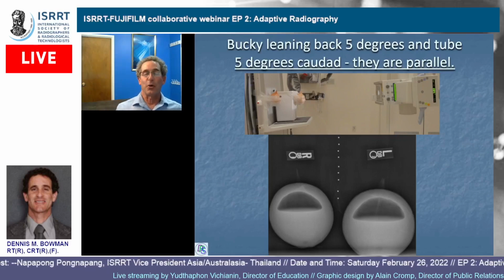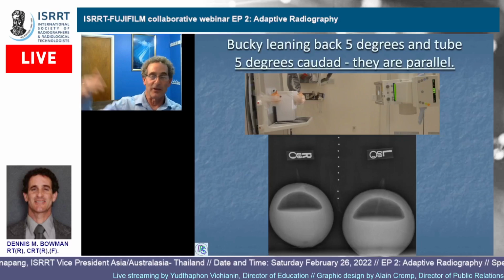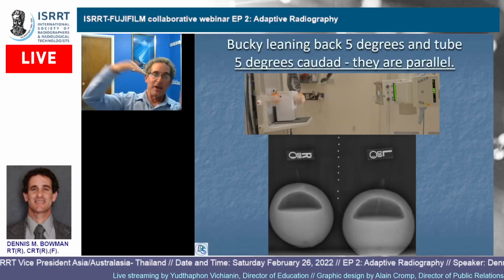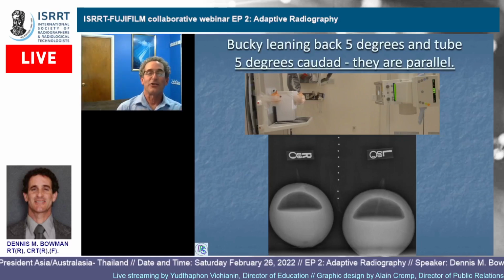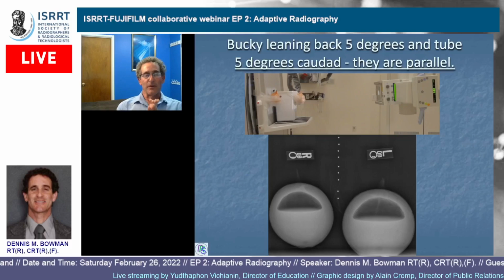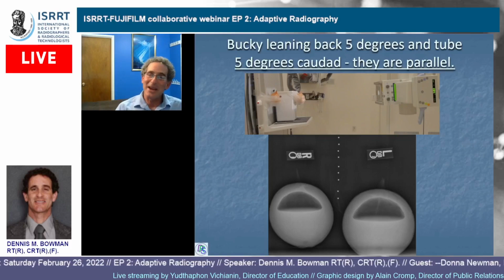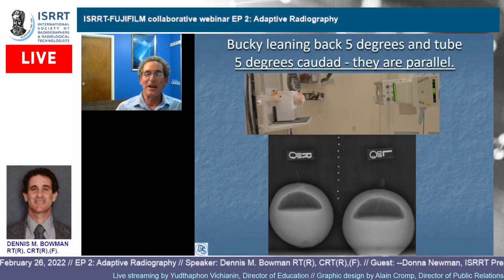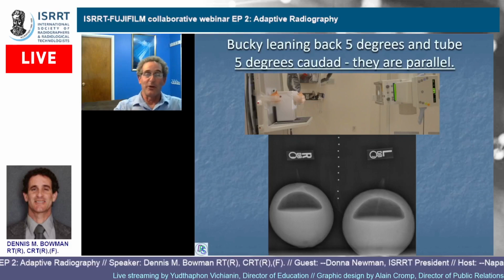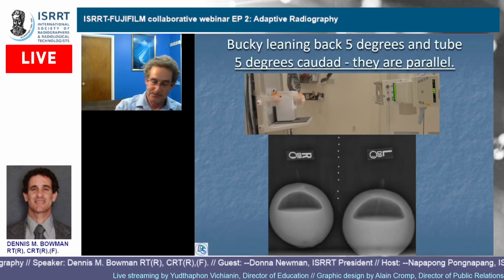And we did that until one day a radiologist walked by and saw it, and went, what are you doing? And the tech said, I'm staying parallel. And he went, don't do that, because then we don't see the air fluid level as well, and or free air. We heard what he said, but it was like, is he right? I don't remember ever reading this before anywhere. So we did this experiment to prove either he's right or he's wrong, and he was absolutely right, and now I'm going to show you why.